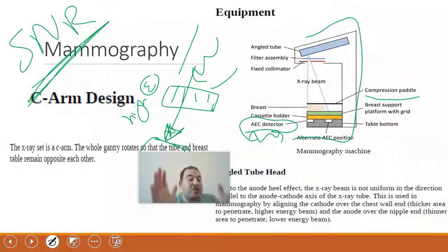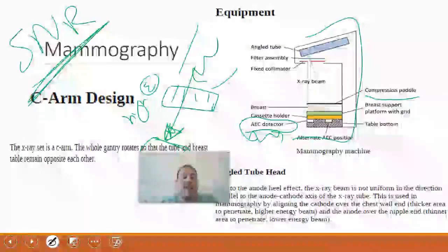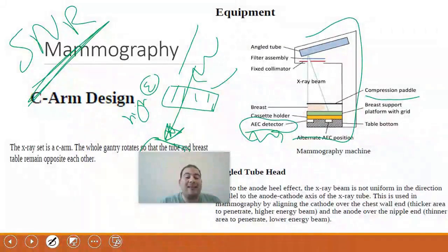So he has an equation that he knows. The specific thickness should yield a certain attenuation. If I took a picture and it showed me an attenuation of this amount, he will plug it into the equation to find out how much thickness he has, and then he will adjust the parameters based on this information.